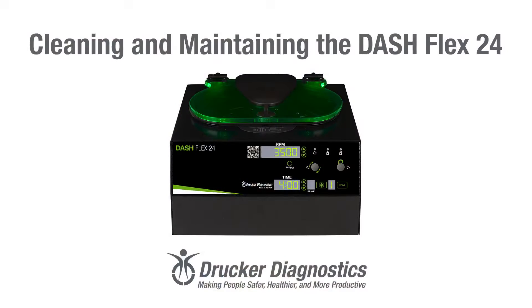Hi, I'm Dawn with Drucker Diagnostics and today we're going to learn how to clean and maintain the DashFlex 24 centrifuge.